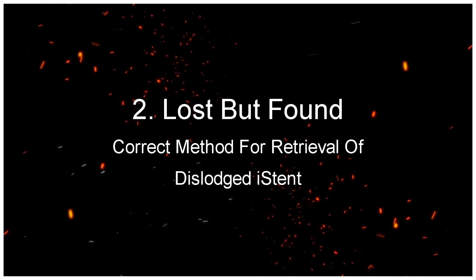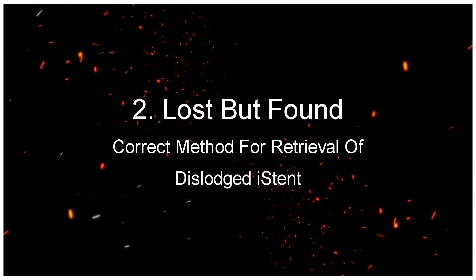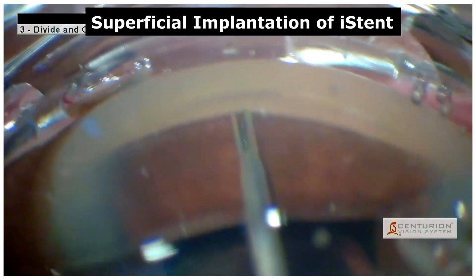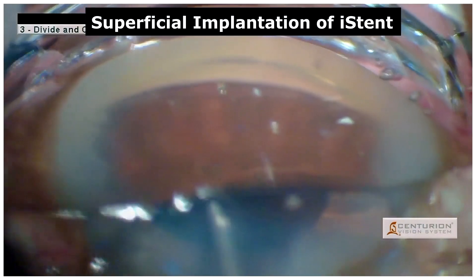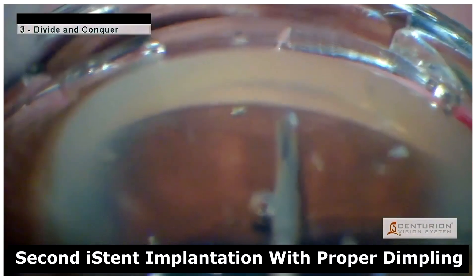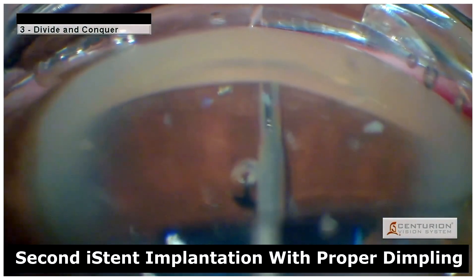Lost but Found: correct method for retrieval of a dislodged iStent. In this case, due to improper dimpling technique, the iStent was implanted superficially and hence was dislodged. Continuing the procedure, a second iStent was implanted with the proper dimpling technique.